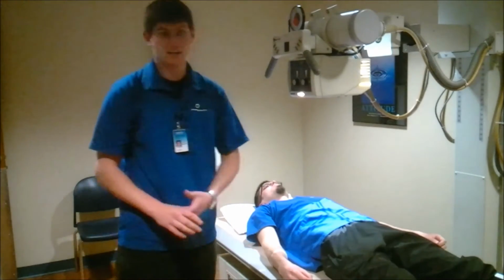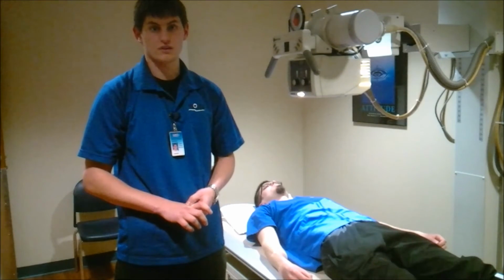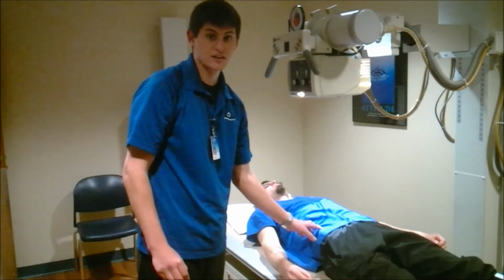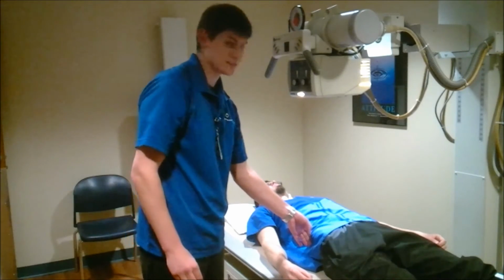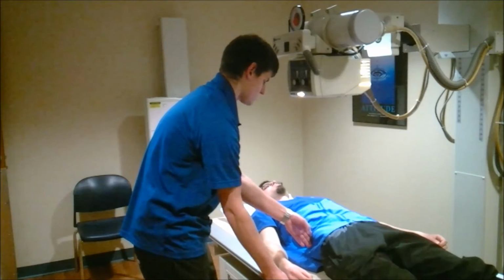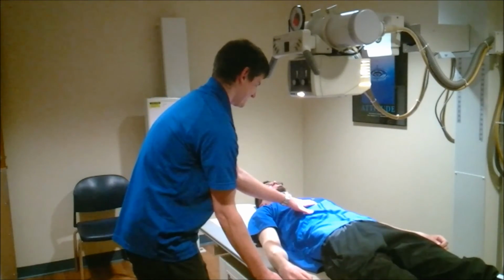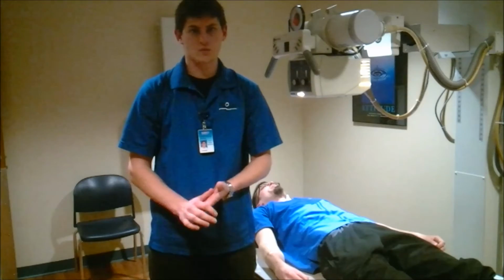Okay. Now that we have that done, we're going to palpate for the anterior superior iliac spine of the crest. We found that, so now we're going to roll up, move our fingers to the top of the crest. We're going to center there, which looks good there. Next, we're going to make sure that his mid-sagittal plane is aligned. There we go. Next, we're going to want to shield our patient.